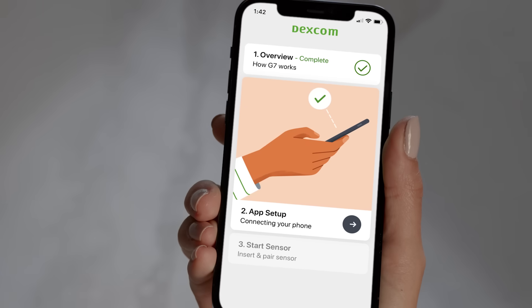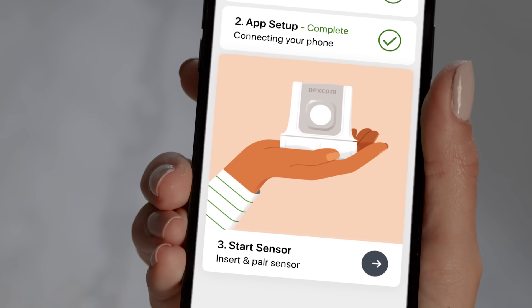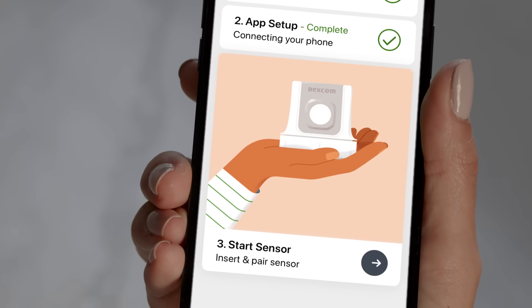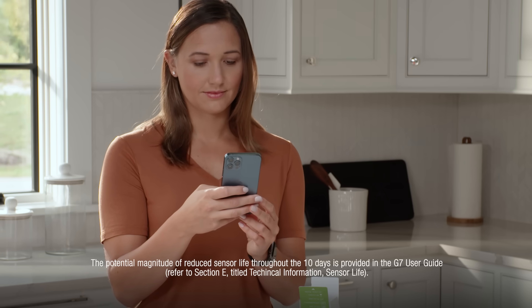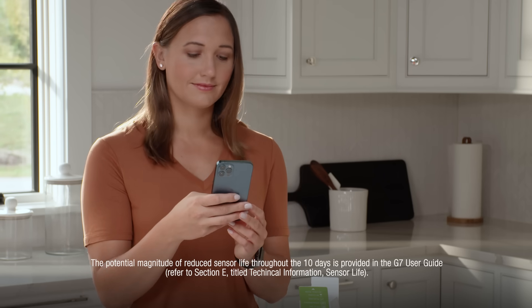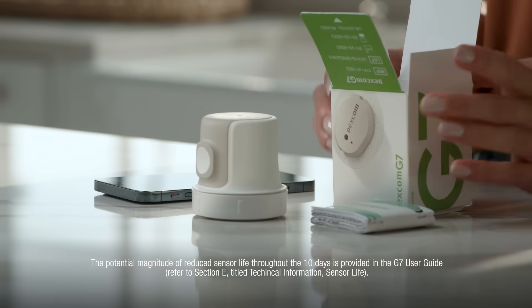Then you will connect your phone to your Dexcom G7. You will enable Bluetooth and set other required phone settings. The app will then provide you with instructions on how to insert your sensor. Let's insert the sensor and apply the overpatch. Follow the insertion instructions carefully, as extra care may help you keep your sensor on for the entire sensor session.